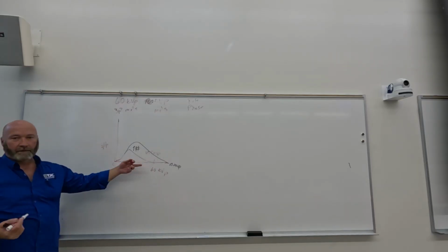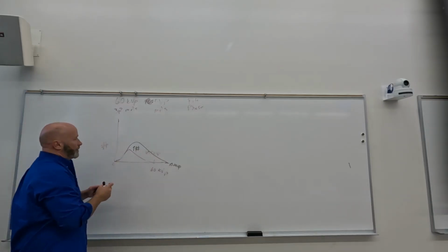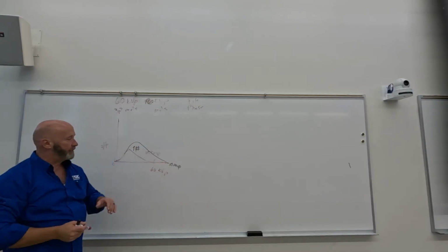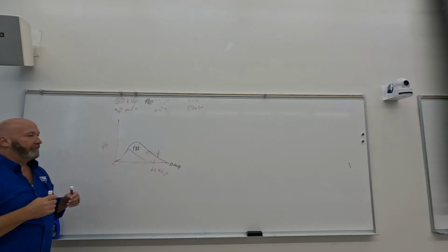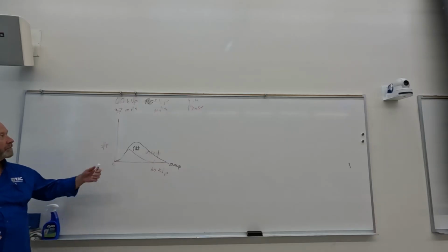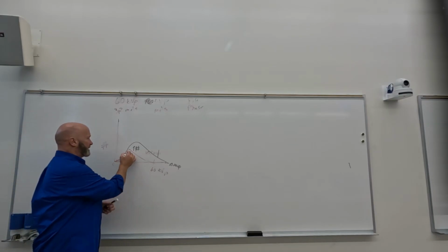So with 60 kVp, you don't have a characteristic spectrum, right? Because we only count K-shell interaction. So when we change from 60 to 100 kVp, we got an increase in numbers, we got an increase in peak energy. We also now have a characteristic spectrum at 69.5. But if you remember, our average energy is always 1/3 of our peak energy. So what's 1/3 of 60? 20. Yeah, somebody said 40. 20 kVp is our average.